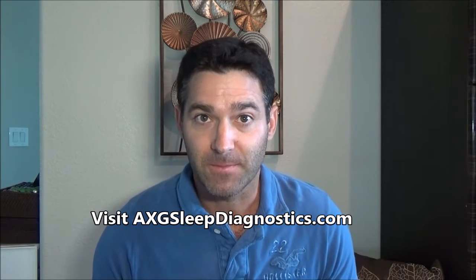That is the main difference, but another large difference is body position. When you look at type 3 and type 4 studies, type 4 is just, throw that out. It's so bad, I don't even want to talk about it. Type 3 has everything mine has, except it does not have your heart data, your EKG rhythm, and oftentimes it does not have body position.